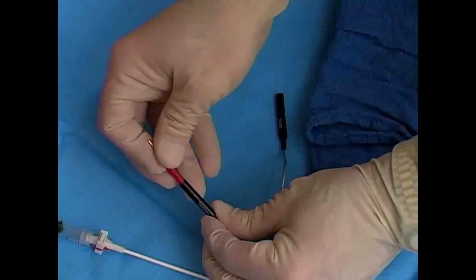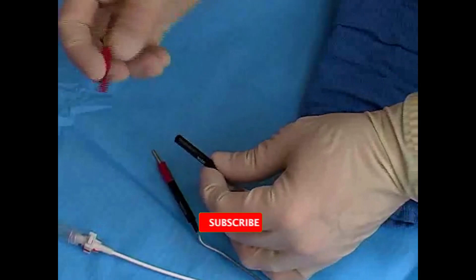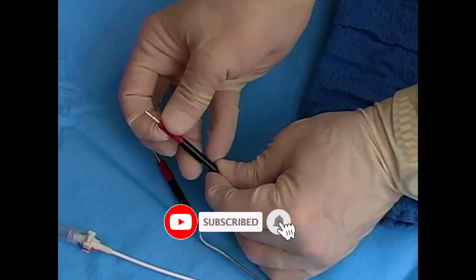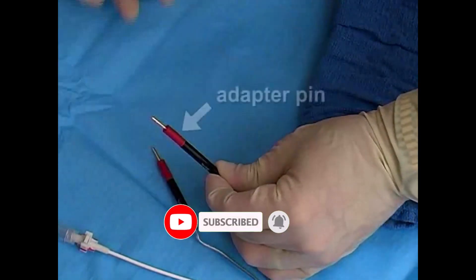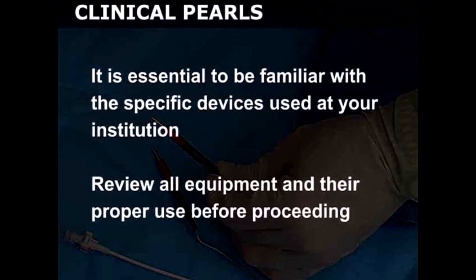Enlist the help of an assistant to prepare the pacemaker generator. Depending on the equipment used, adapter pins may be required to attach the terminals of the pacing catheter to the pacemaker. It is essential for you to be familiar with the specific devices used at your institution. Review all equipment and their proper use before proceeding.